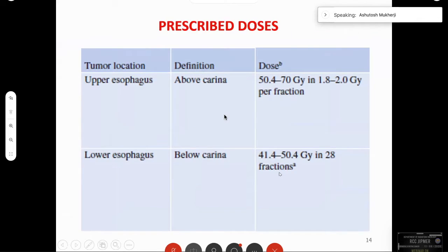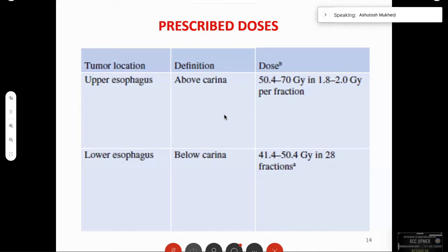Regarding prescribed doses: the upper esophagus above the carina, including cervical or upper thoracic esophagus, is typically treated as the lower hypopharyngeal field. We prescribe doses of 66 to 70 Gy in conventional fractions, including the supraclavicular region going towards the manubrium — almost like a mini mantle field.